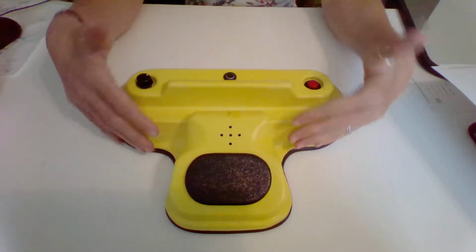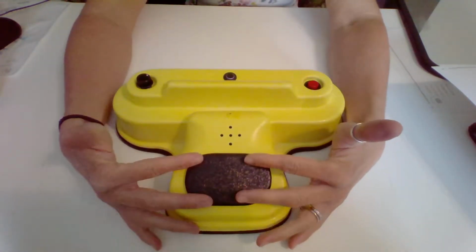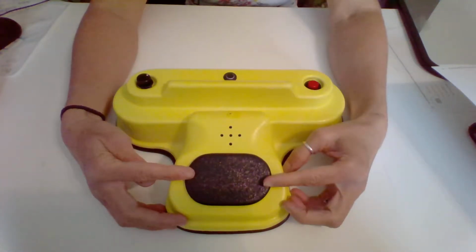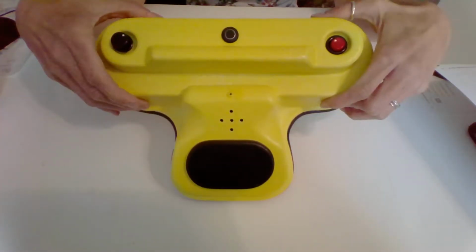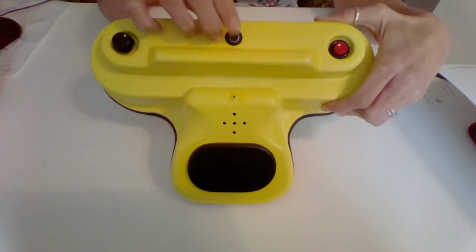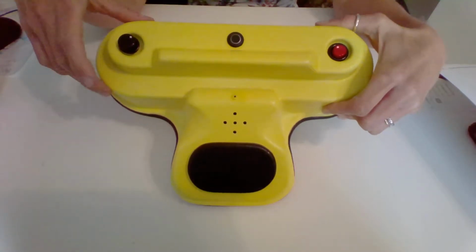So on the front panel, you have a black, just plastic piece right here. This button is your play button, basically, but you also use it to record. This is your speaker. This is where the sound comes out. This is just another black dot on the back here. This doesn't do anything really that I know of. You can press it, it doesn't do anything. It's just like a finishing piece almost.